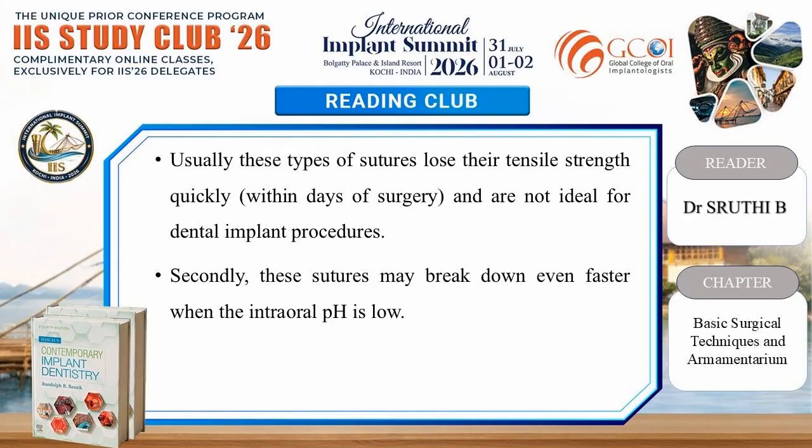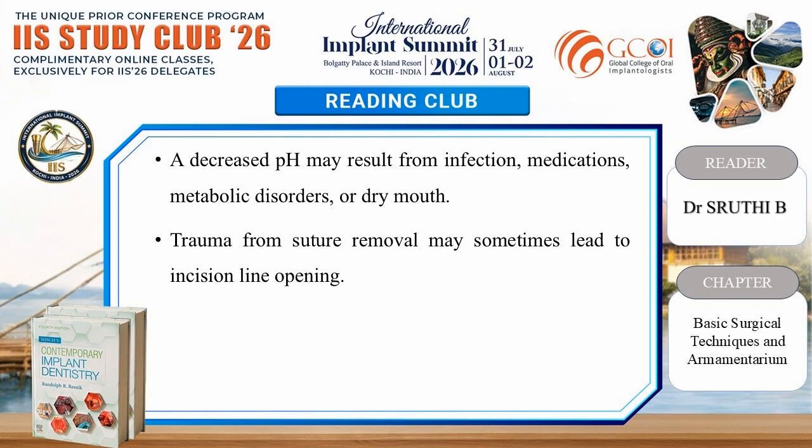Usually, these types of sutures lose their tensile strength quickly, that is within days of surgery, and are not ideal for dental implant procedures. Secondly, these sutures may break down even faster when the intraoral pH is low. A decreased pH may result from infection, medications, metabolic disorders or dry mouth. Trauma from suture removal may sometimes lead to incision line opening.